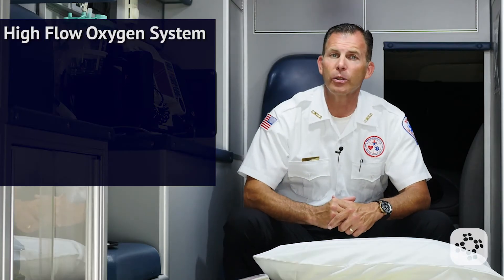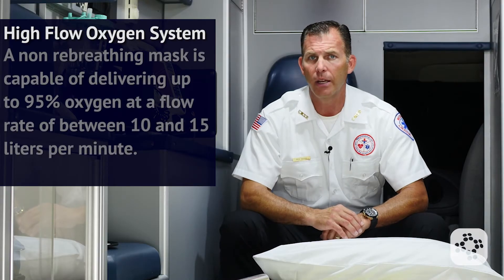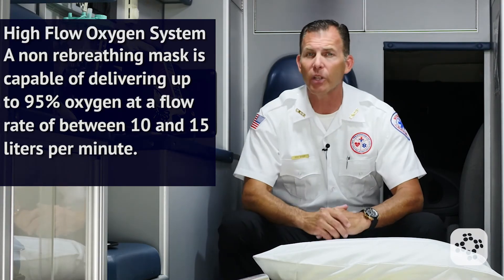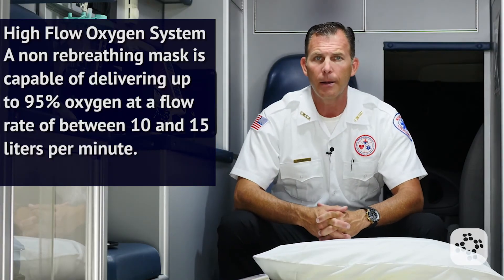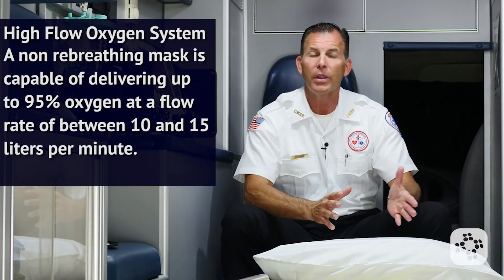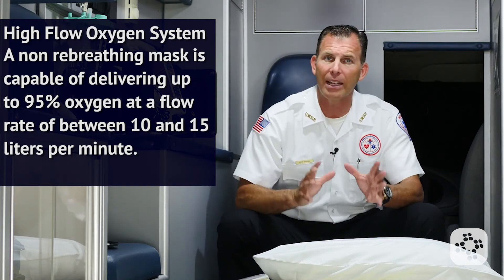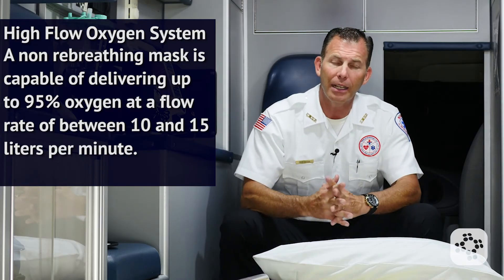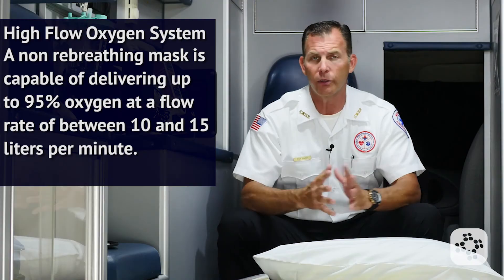High-flow oxygen systems are much more reliable when it comes to delivering higher oxygen concentrations. A non-rebreather mask is capable of delivering up to 95% oxygen at a flow rate of between 10 and 15 liters per minute. This does depend, however, on how well the mask seals to the patient's face, and it's important to adjust the oxygen flow rate to keep the reservoir bag inflated and not allow the child's inspiratory effort to collapse the bag, as that will affect the oxygen percentage delivered.